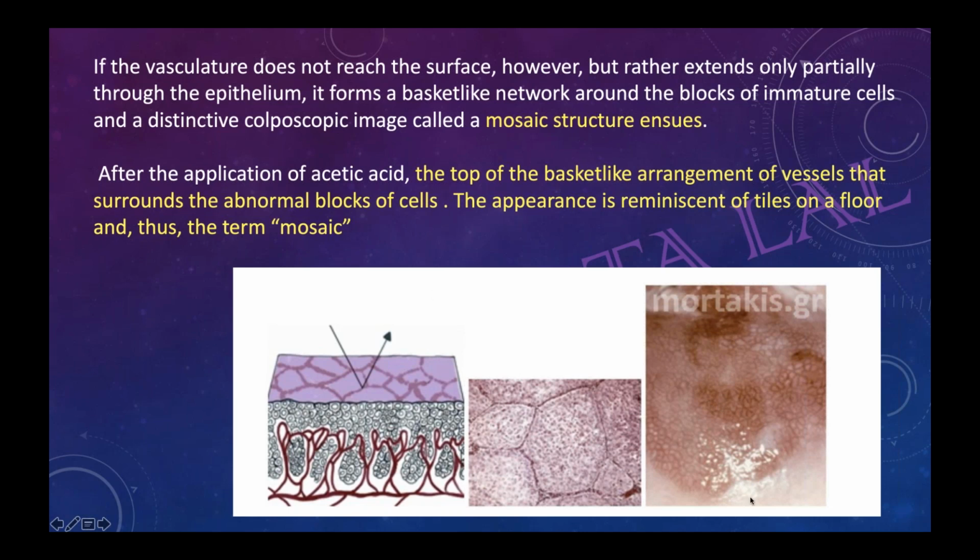You can see some blocks here, and actually these are showing the capillaries surrounding the cells, like a basket-like arrangement.